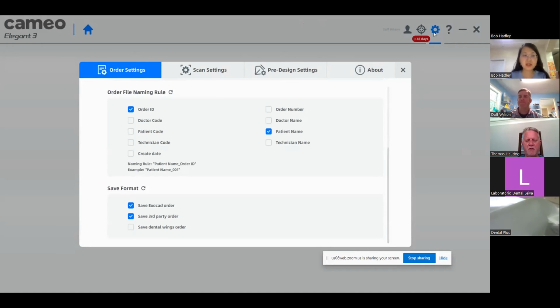Okay. Then, Dolph, the second question is from Dr. Ricardo. He said, thanks. I'd like to know how you can get the STL file. And the other question is how you can make orthodontic study models.